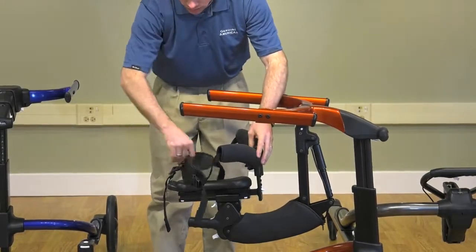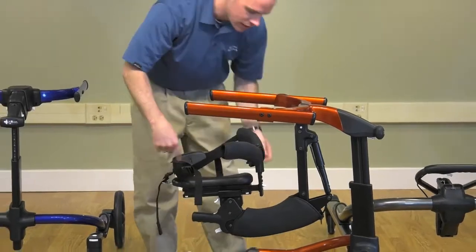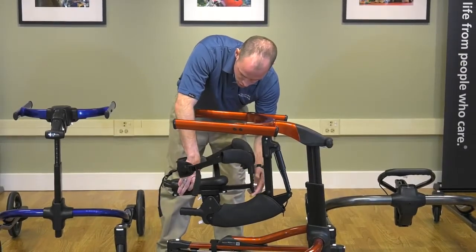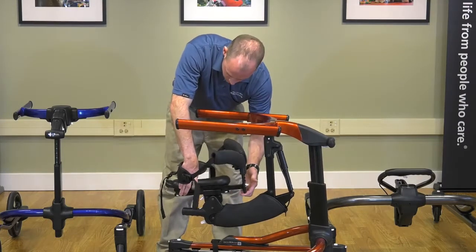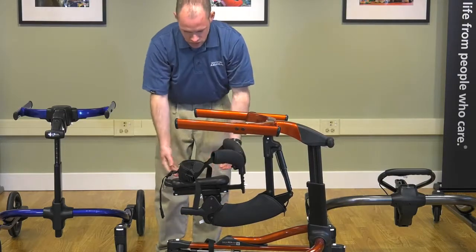Then we have the hip corral and the back pad here, which secures the client into the pacer. The hip corral can also slide forward by pressing this white lever at the front and pulling out. And it has 6 positions covering a range of 3 to 4 inches in which you can adjust the position of the hip corral in relation to the seat.